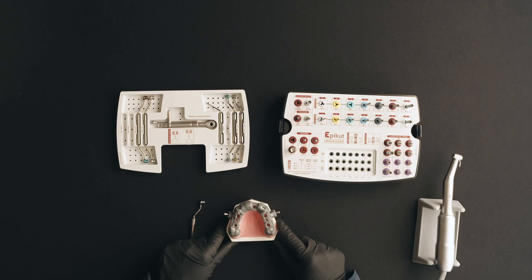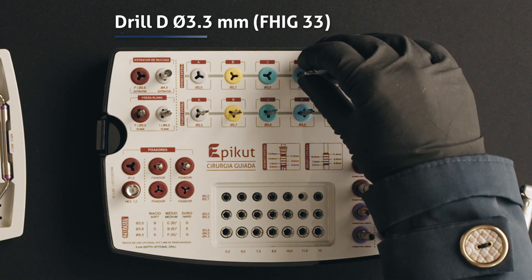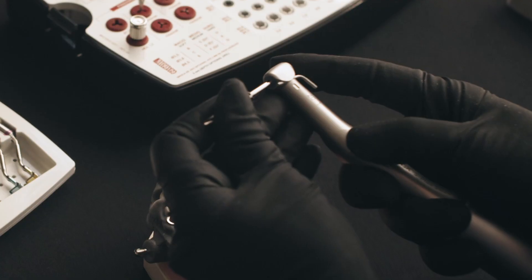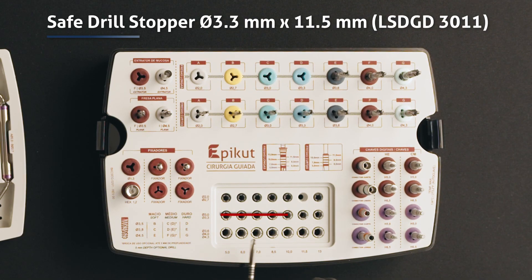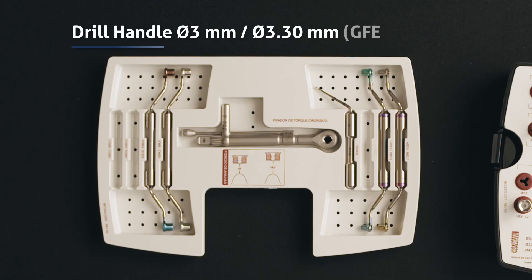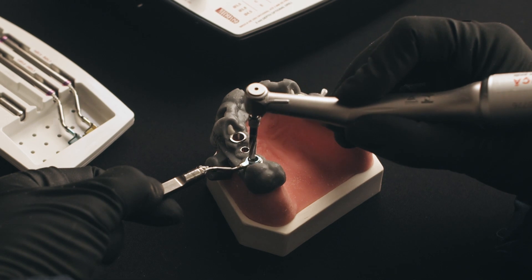The next drill in the sequence is drill D with a diameter of 3.3 millimeters. Use the SAVE drill stopper with the preferred length. Select the drill handle for the 3.3 millimeters drill, place it on the sleeve of the guide, and start drilling.